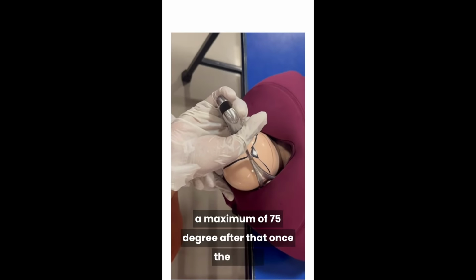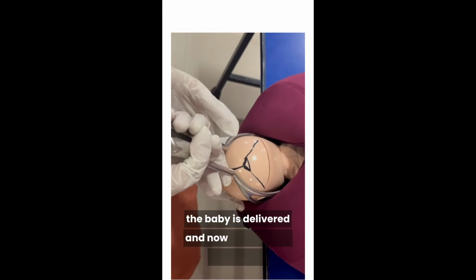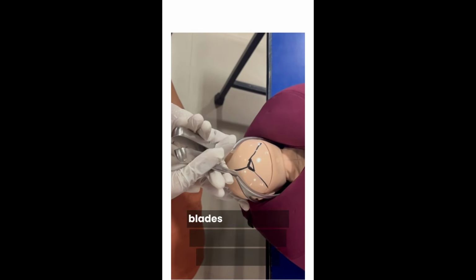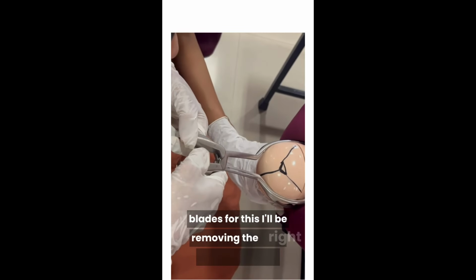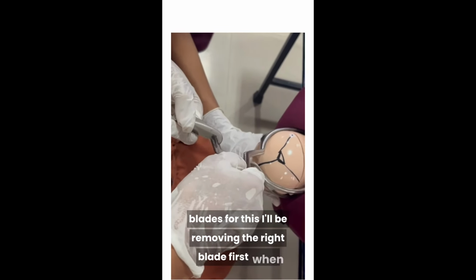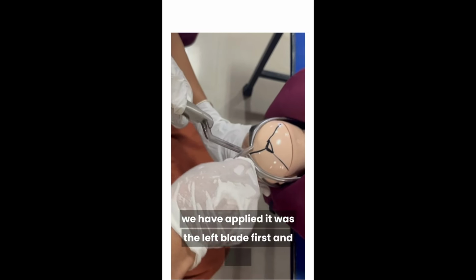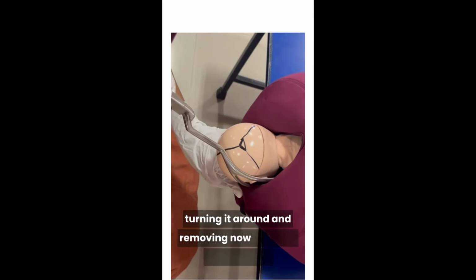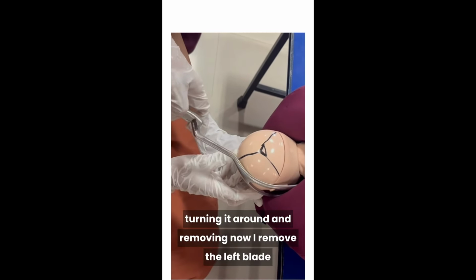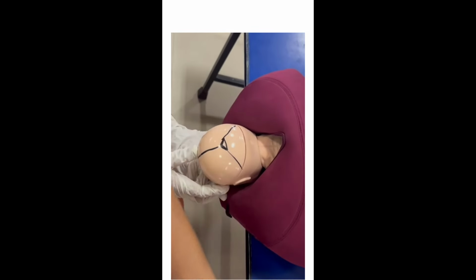After that, once the jaw of the baby is delivered, now I unlock and remove the blades. For this, I will be removing the right blade first. When we applied, it was the left blade first, and then turning it around and removing. Now I remove the left blade. I go in the opposite direction and then remove the blade.